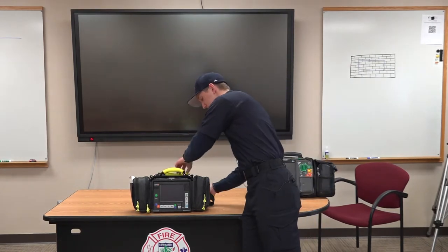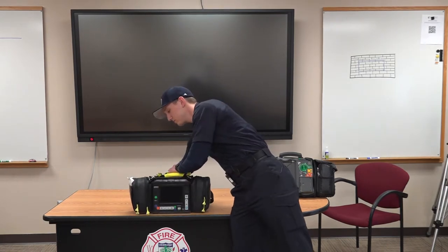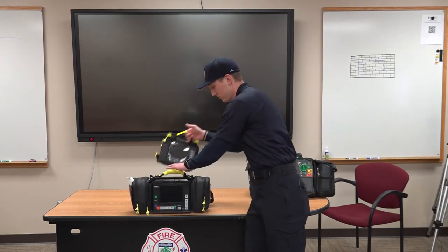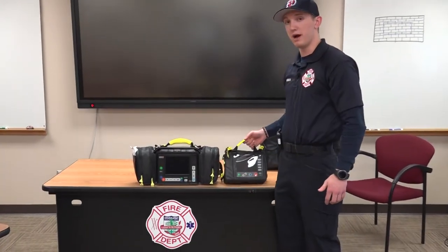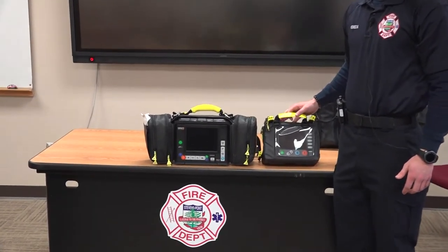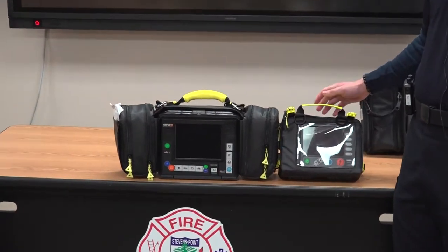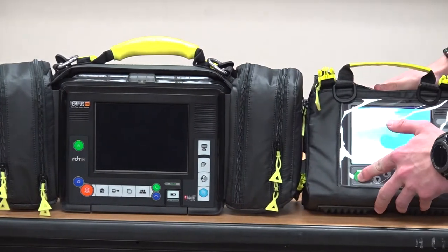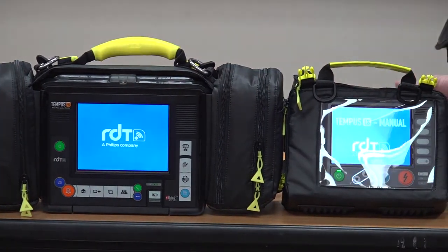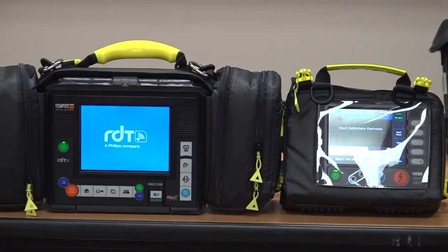I'll show you how you disconnect them. This is the defibrillator. Both of these combined weigh about 6.5 pounds. To turn them on, all you need to do is press and hold the green button on each one. It does take a little bit of time for them to boot up.